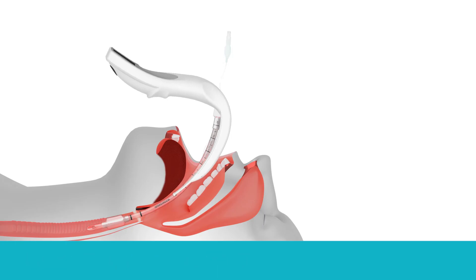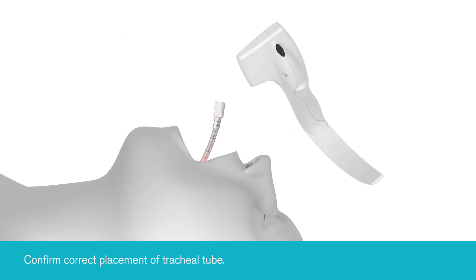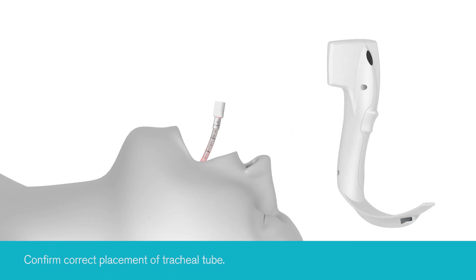Confirmation of correct placement of the tracheal tube should be assessed by the use of waveform capnography and other methods in accordance with applicable guidelines. iView should then be switched off by depressing the on/off button.